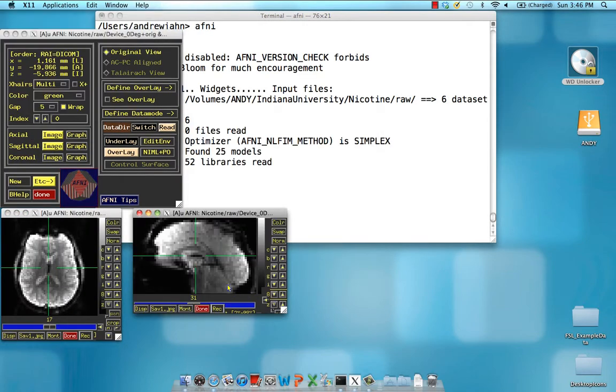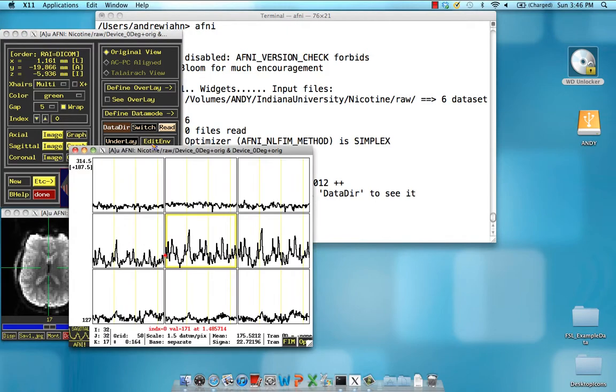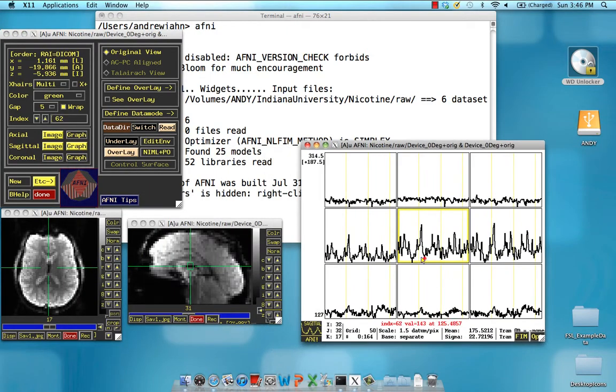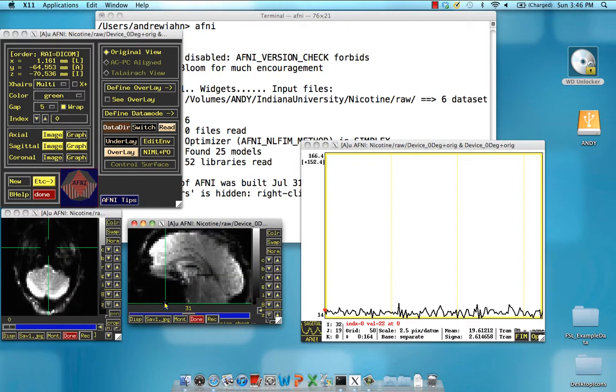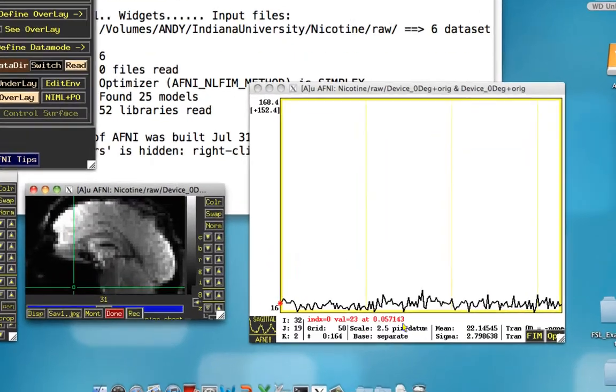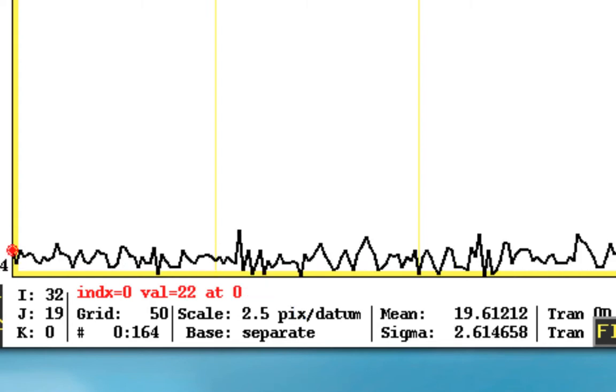To show this example, I'm going to open up a time series for one of these images. And if I start at the very beginning here, and I start at the very bottom slice, which in our scanner is the first slice that's acquired, we acquire in ascending interleaved order, and I start scrolling up just by tapping the up button, notice the change in this number right here. This is the actual time at which the slice is acquired. So notice at the very beginning slice, it's time zero.